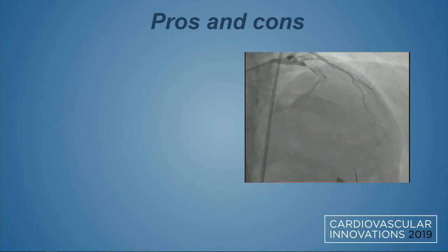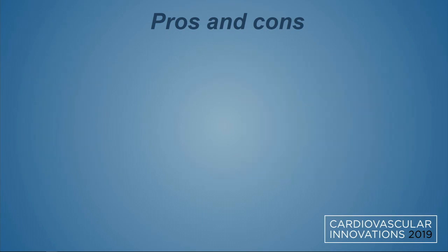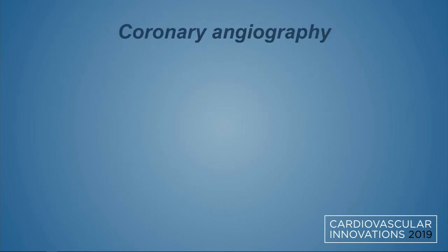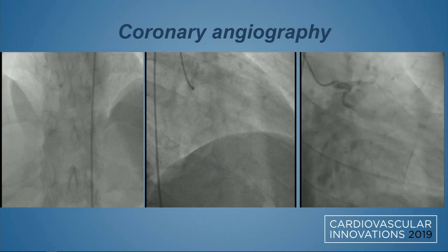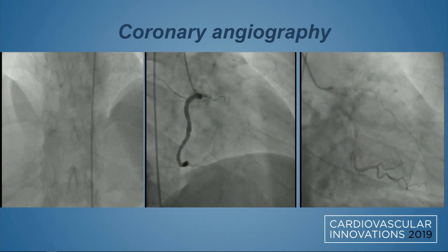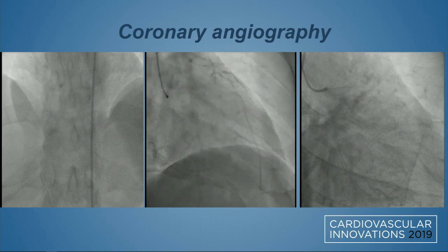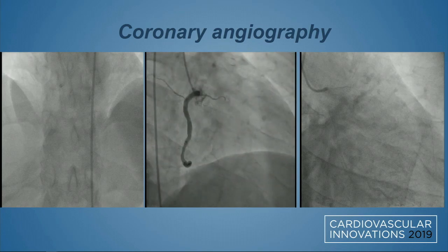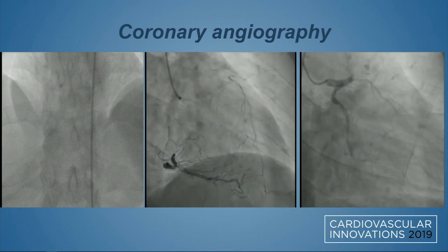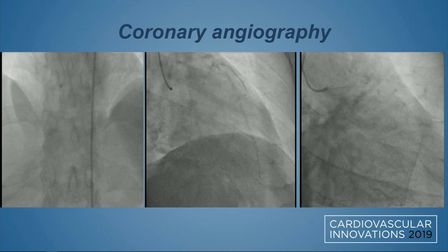Because here we are blind, we don't know where to put the stent. Especially the distal LAD was diseased in the retrograde filling. Still feel that this was a continued dissection, because the flow into the aneurysmal segment just doesn't flow freely like it does in an aneurysm. If you go back and follow it frame by frame, look at it, I think here was the continued dissection, which thankfully did not perforate.